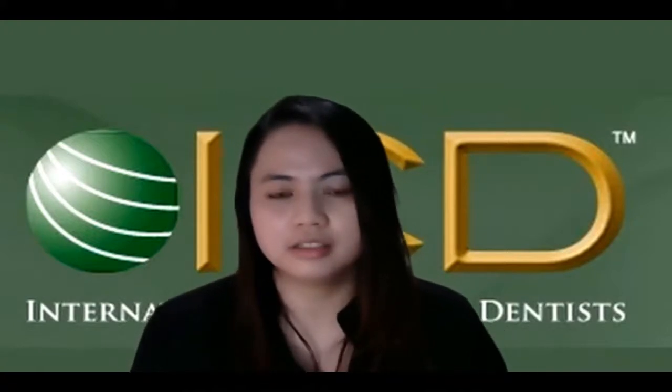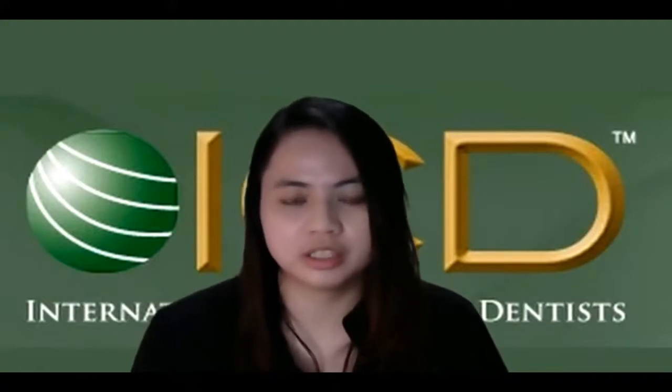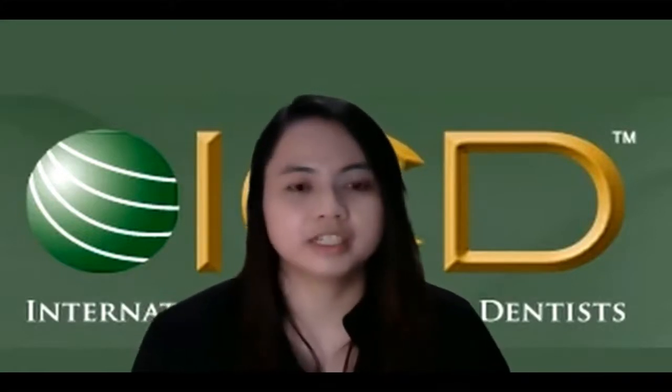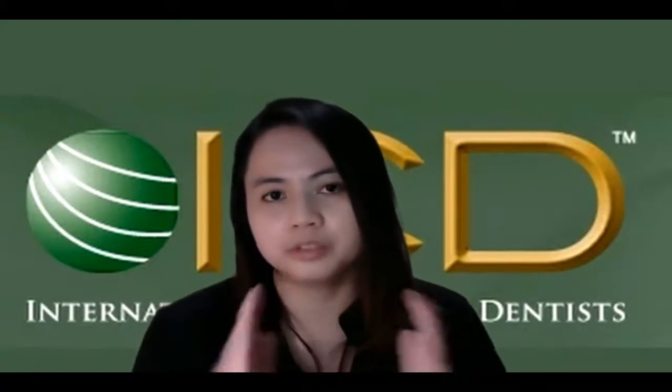Is it possible to do a digital wax-up design with CAD software or 3D printing before mock-up creation? Yes. You can scan intraorally, and then design and plan what the restorations will look like. And then you don't even have to print it. You can just show it to the patients, like the mock-up will be in a 3D image.